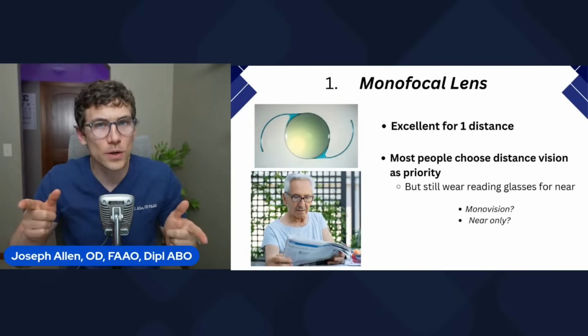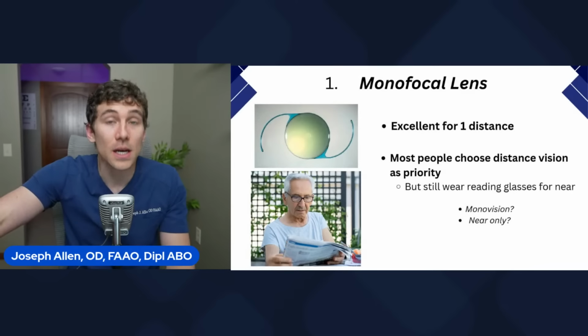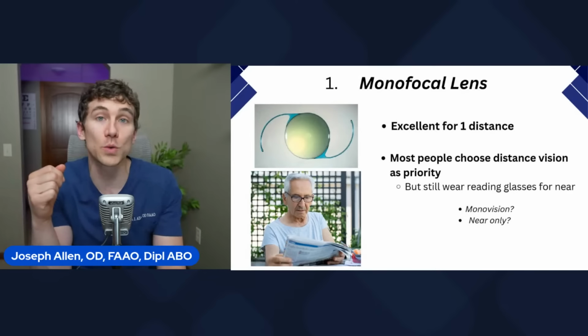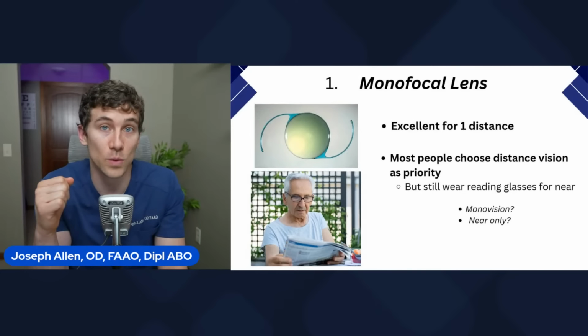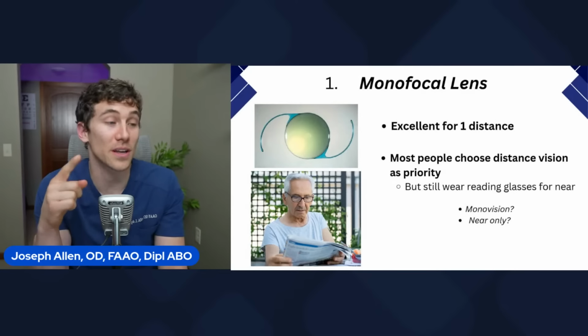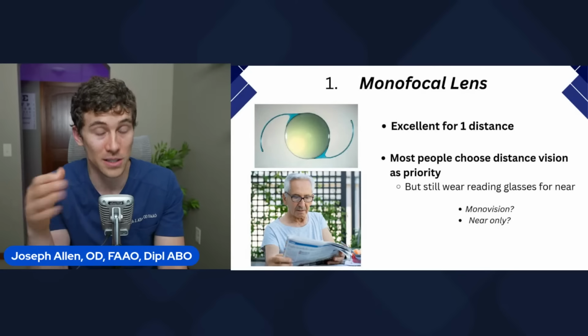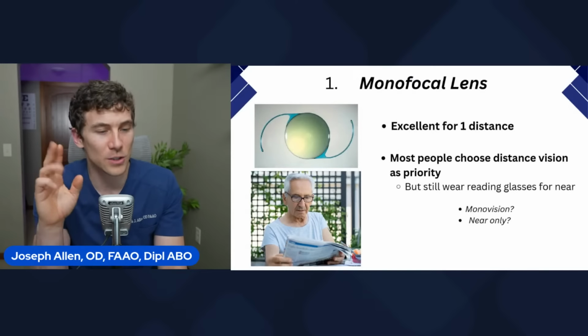It's kind of backwards, and most surgeons I've worked with don't recommend that. However, there are patients who choose that and they have good success with it. But it's something to discuss extensively with your surgeon if you're going to be considering having lens implants just to see up close. I just think it's really good to think about that.